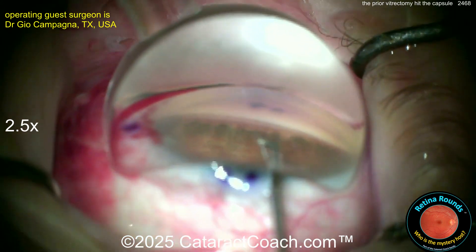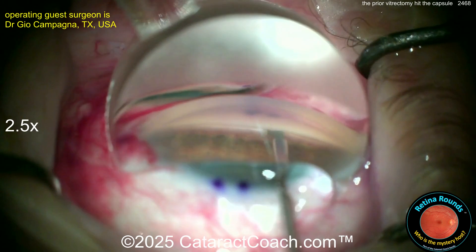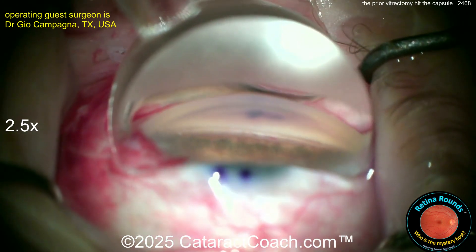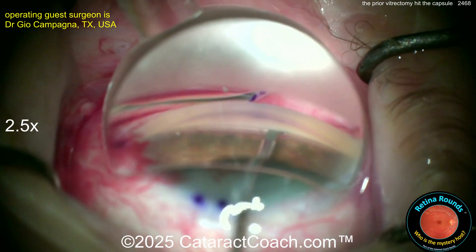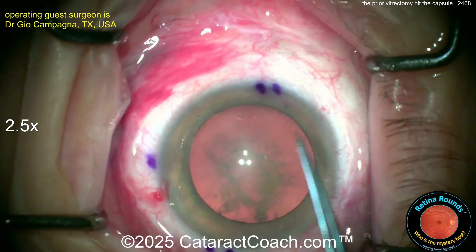That doctor should probably watch retinarounds.com — it's coming in less than a month. Here's a KDB procedure being performed because the patient also has steroid-induced glaucoma. You can imagine all those retina surgeries — this patient was probably on topical steroids for a year. KDB going both directions here. That's the Kahook dual blade. Again, that opened up very nicely.